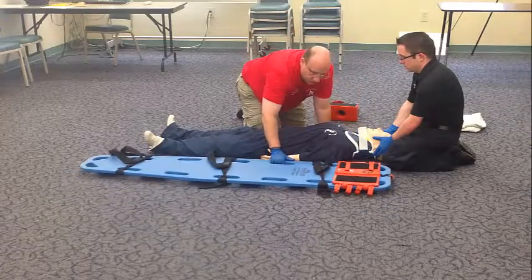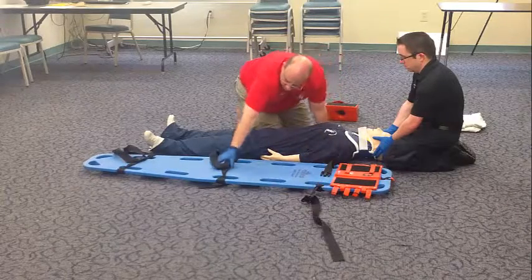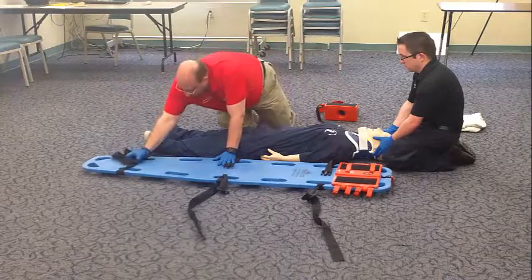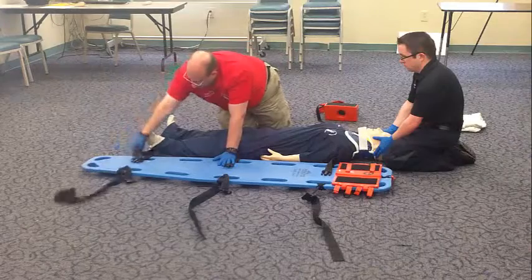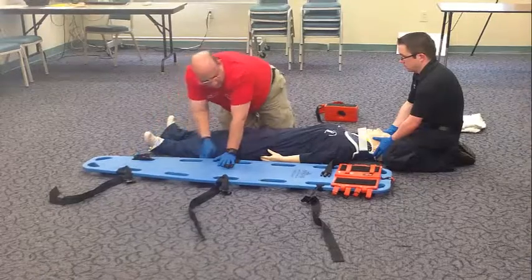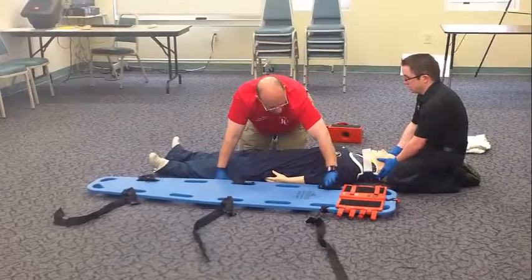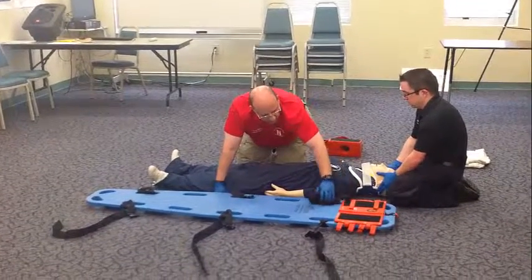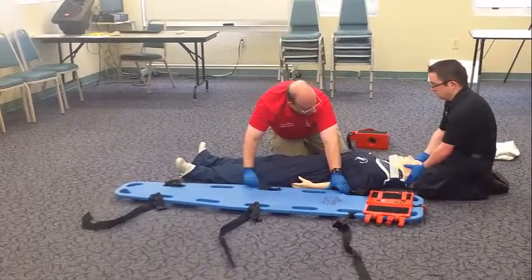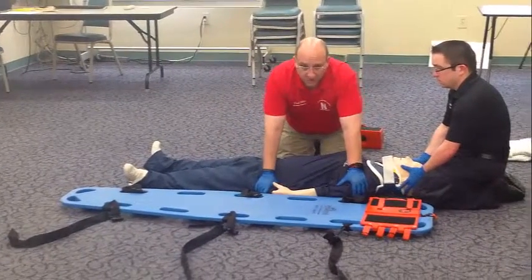I will position the long spine board next to my patient. I'll tuck my straps into the handles. At this point in time, I will need the assistance of my other professional partner to log roll the patient.